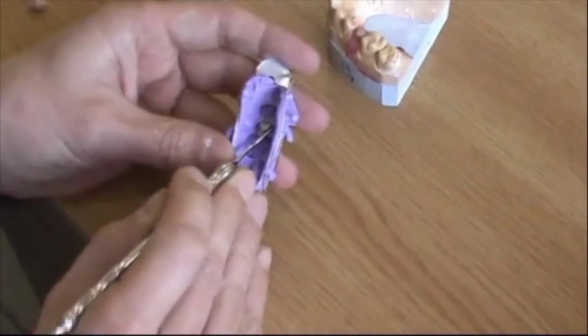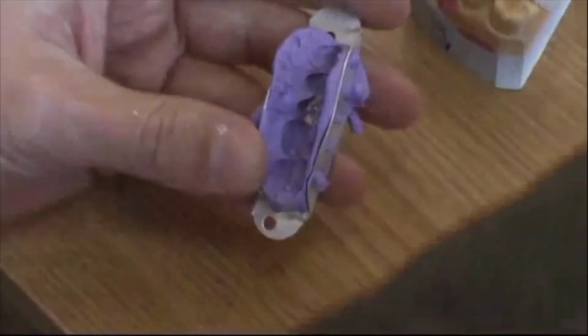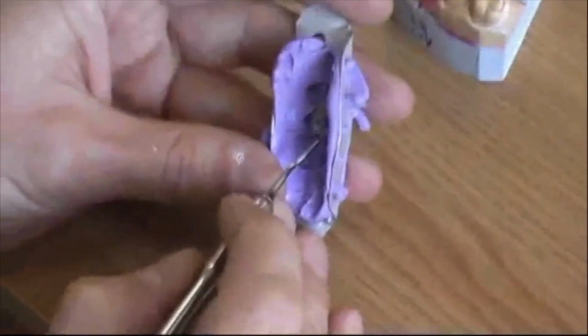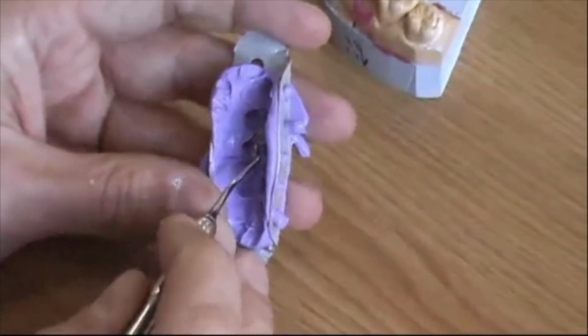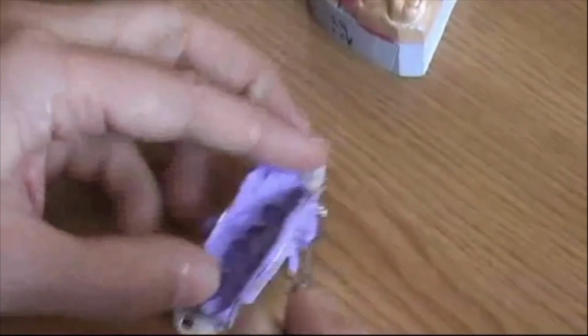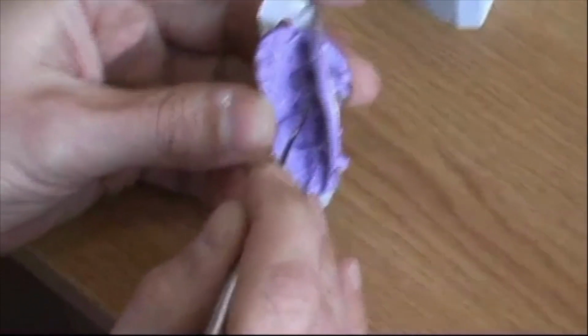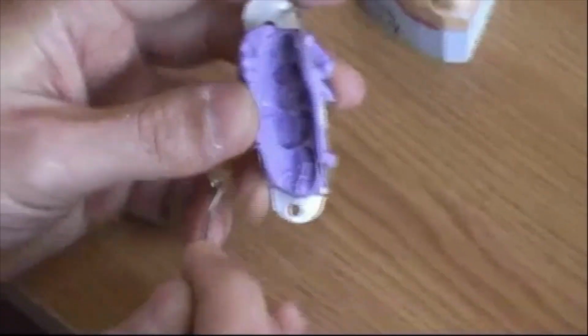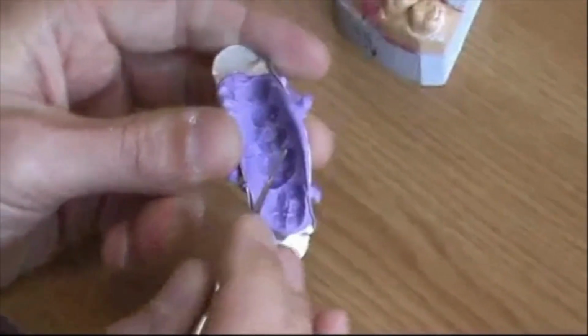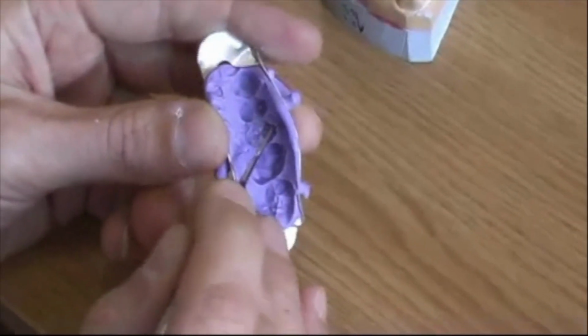We scratch a little bit, we take out the cement that we placed, we clean everything up. We could use some water and air spray. You clean this index. If you did the temporary fillings in composite, you don't need to do that anymore. And with this, we will do the initial temporary restoration. That can be left there if the technician is doing the final one quickly. Then you don't need another lab-made temporary.